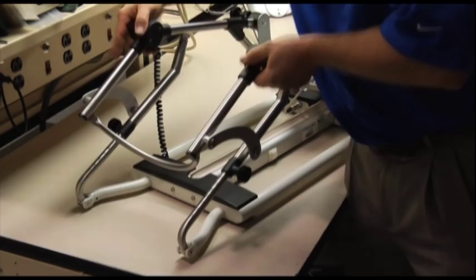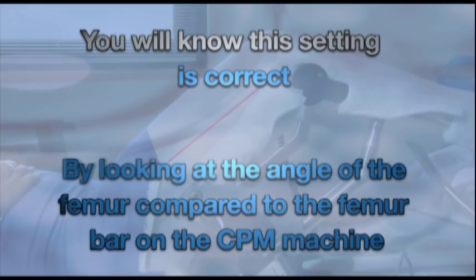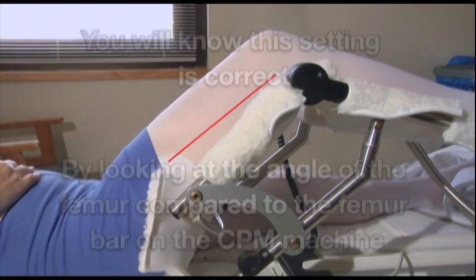A CPM machine set in the middle range will fit the majority of your patients. You will be able to verify that this setting is correct by looking at the angle of the patient's femur compared to the angle of the femur bar on the CPM machine. The leg should be parallel with this bar as it moves into greater flexion angles.